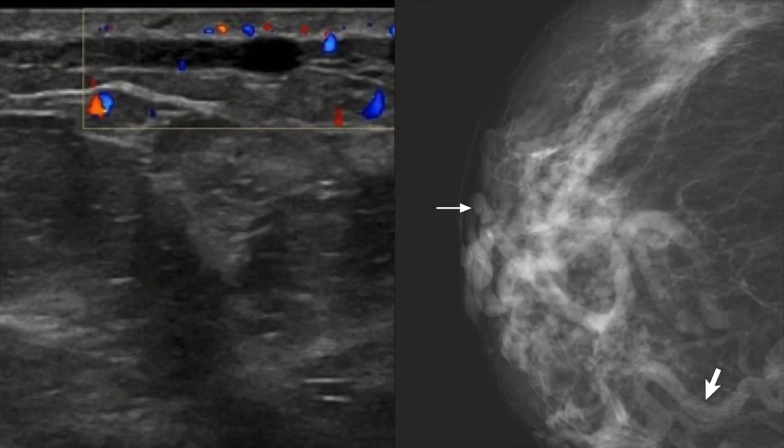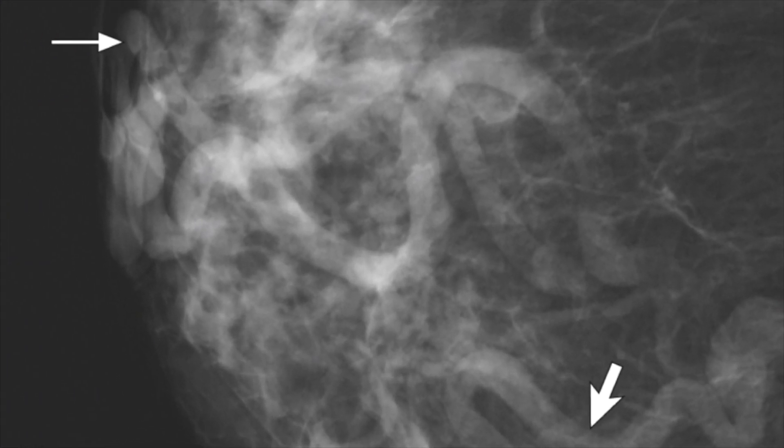On mammography, Mondor's disease can have a negative mammogram or, rarely, a long tubular structure corresponding to the thrombosed vein.